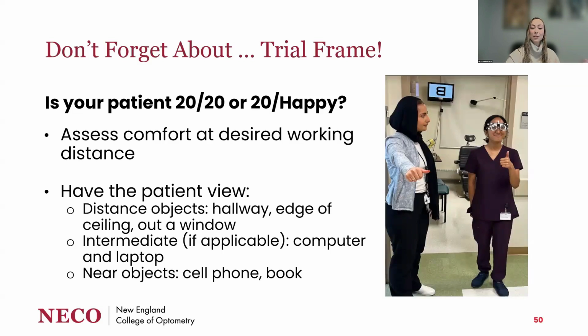Intermediate might be a good option for someone who works on a computer often or a laptop. You can have the patient actually sit in front of the computer and demonstrate their true working distance between them and their home computer for you. And then you can trial those lenses to what is optimal and most comfortable for them.